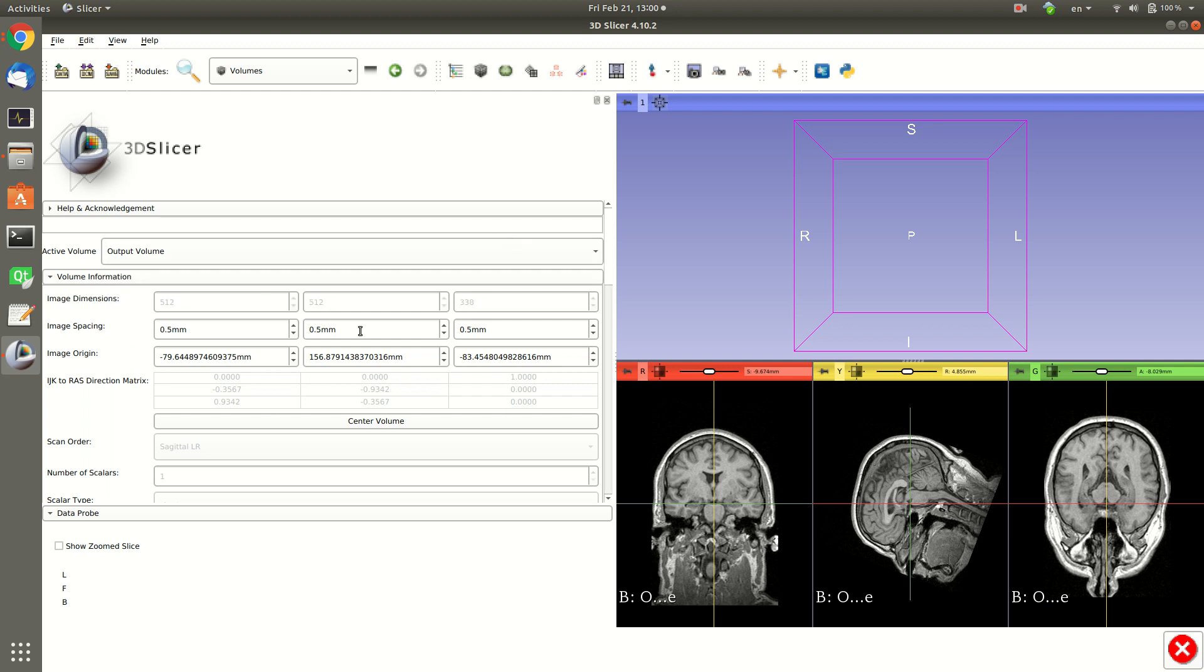Yes, now it's finished. You can see here now we have the more high resolution image with more slices.